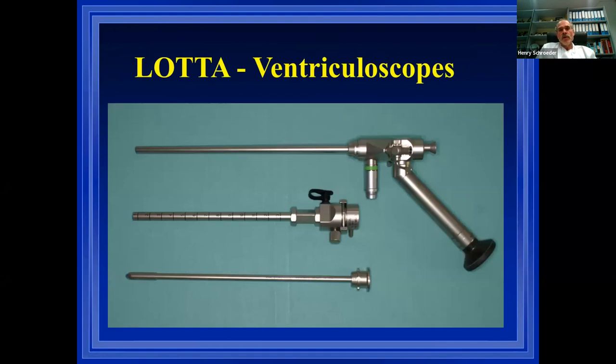What for me is very important is the use of these endoscopic sheaths. Initially the trocar is put into the sheath, then you puncture the ventricle or cyst wherever you want to go, and then you remove it and bring the endoscope in. And that is for me very important because I use this as a tool. I use it as a retractor and I can use it to create an additional space. So when the ventricles are very narrow, I go with the endoscope a little bit back, and then I use the tip of the endoscopic sheath as a room for dissection.